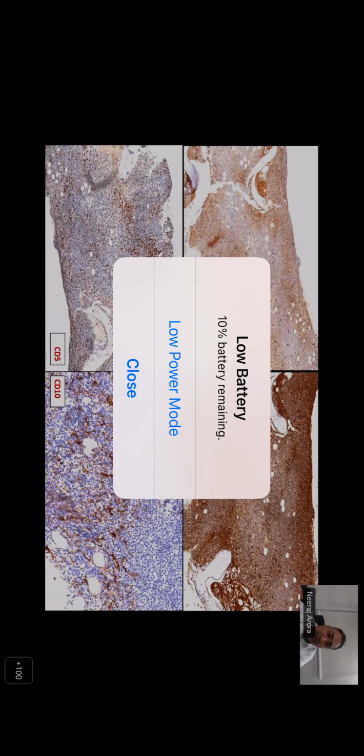Here, subsequently, kappa and lambda immunostains were done, and you could see the kappa being predominant. So it was a kappa restricted population, and since this is a small B cell population, you wanted to rule out other types of lymphomas, such as mantle cell, CLL, or follicular lymphoma, with plasmacytic differentiation. So additional markers like CD5 and CD10 were done, and they were negative.